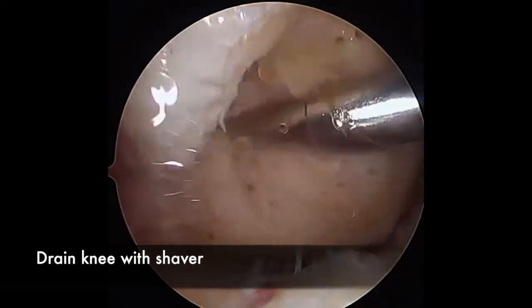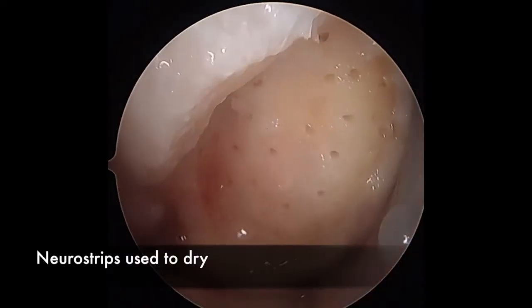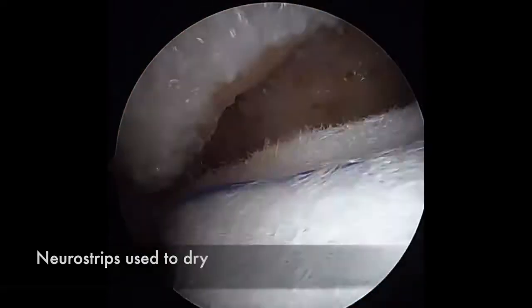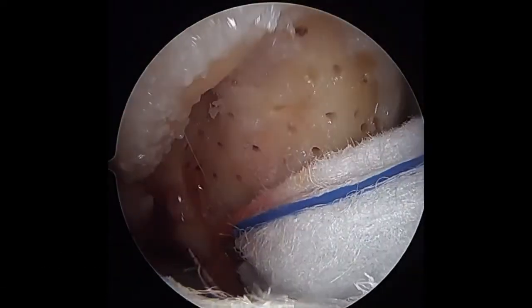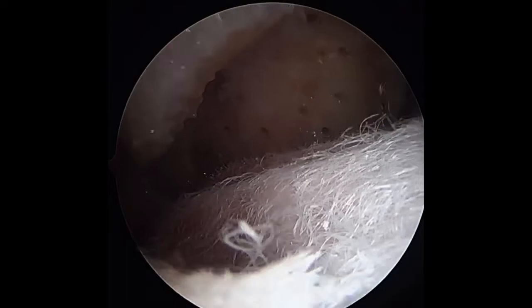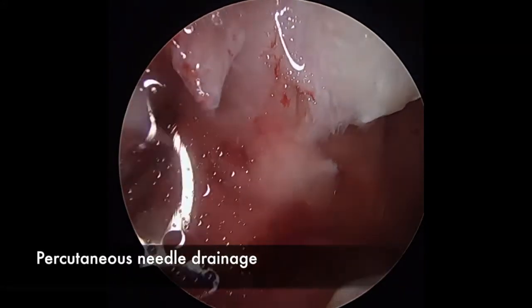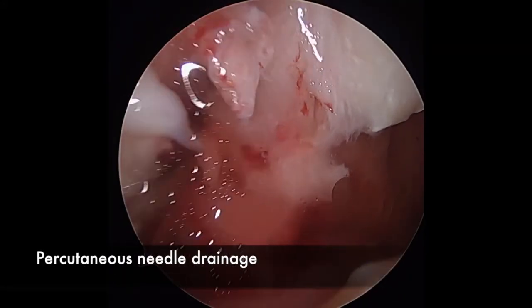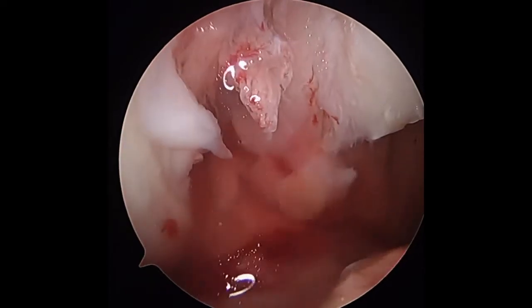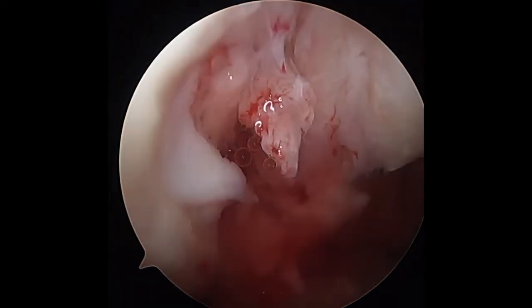A shaver is used to drain fluid from the knee. Neurostrips are then used to completely dry the lesion. A separate percutaneous needle is placed through the patella tendon into the lateral notch and placed on suction to keep all fluid out of the joint.